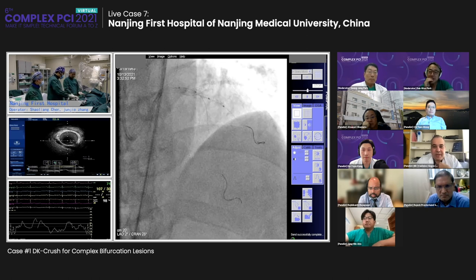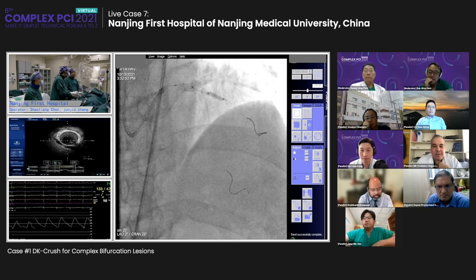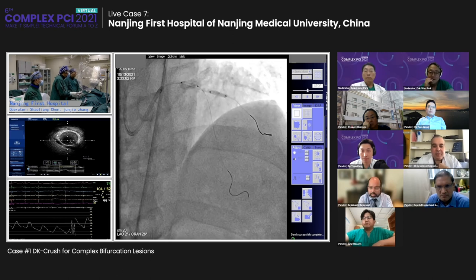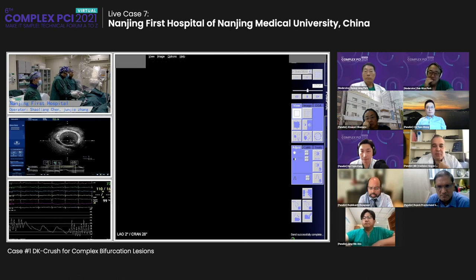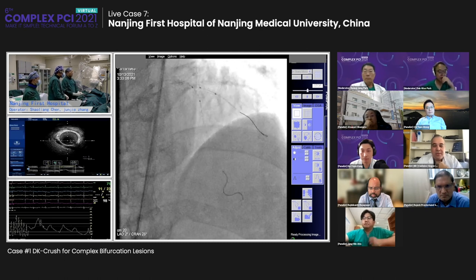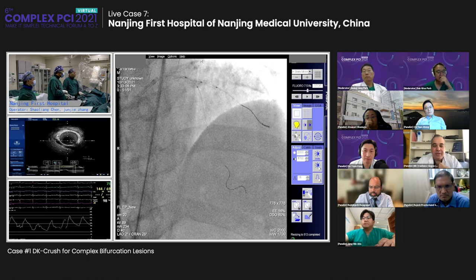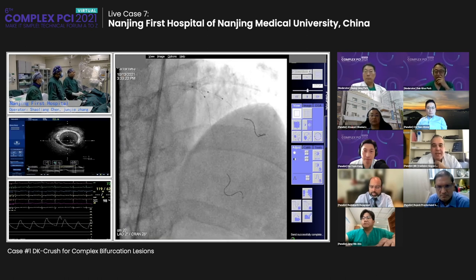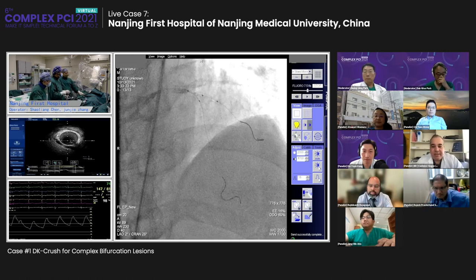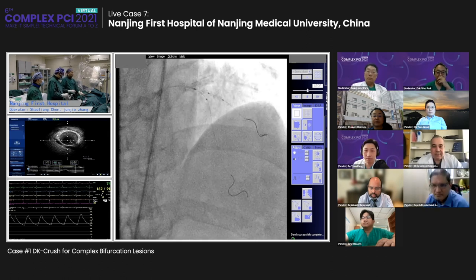Another question, Professor. If you see with IVUS that the proximal LAD is calcified, that gives you a perception that sometimes you will not be able to cross with a stent. Do you do a one-stent technique, and if the diagonal is compromised, then you switch? For less experienced operators, like me, a junior operator, it is very challenging to access the proximal LAD with calcification. If the diagonal is not compromised, we leave it like this. If it's compromised, we try to switch to a two-stent technique.